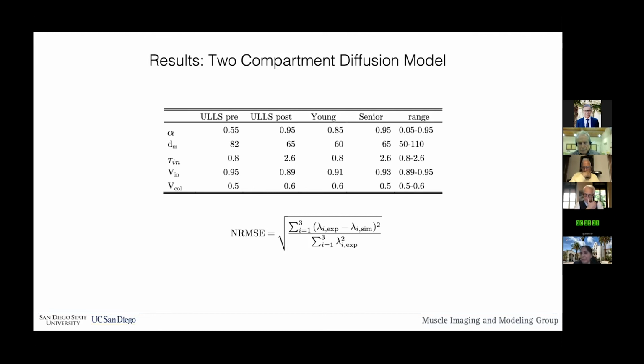The ellipticity is probably not anticipated, but when we look at our strain measurements that Shantanu just talked about, we find that the strain is very anisotropic. So that means deformation only occurs along one direction and not in the other. And that may actually be related to the disuse atrophy, that when you do not have a loading on the muscle and you don't have the deformation that is stretching only in one direction, the fiber cross section may tend to become circular.